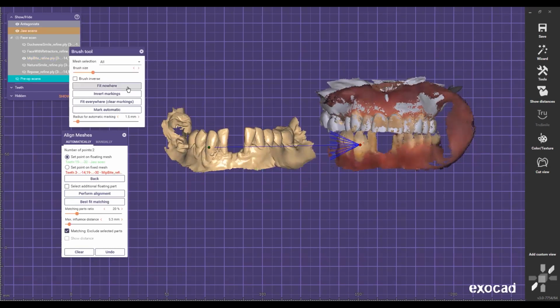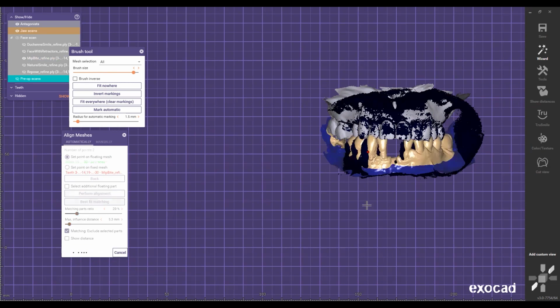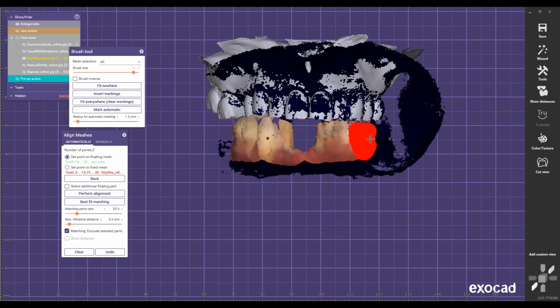Why we decided to use our facial scanner as a bite scanner for these types of cases is because we know that there are a lot of remakes in the industry, especially with these full mouth reconstructions for All-on-X cases, right? There are a lot of remakes because the bite is off when we do the delivery. I'm sorry, I forgot this.